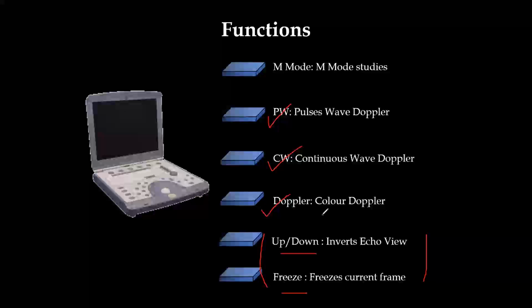So the Dopplers, pulse wave Doppler, continuous wave Doppler, and the color Doppler. So my question to you is, when should you use pulse wave Doppler and when should you use continuous wave Doppler? You can write down in the chat box.